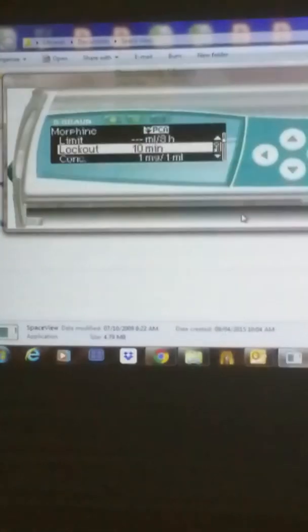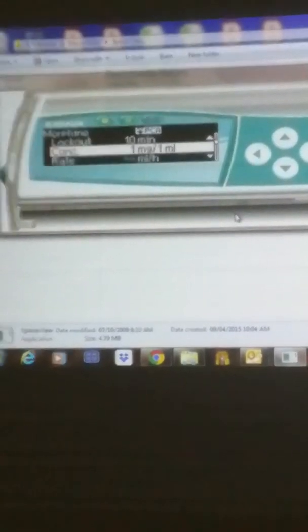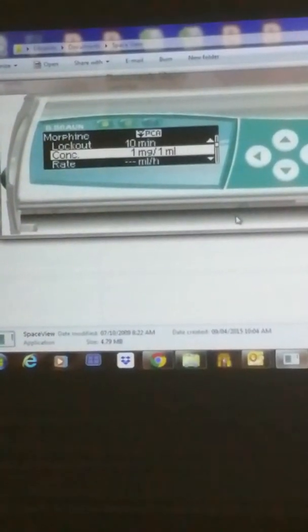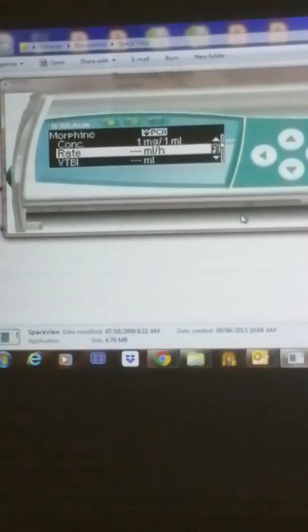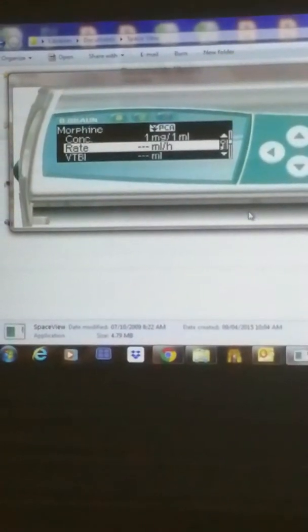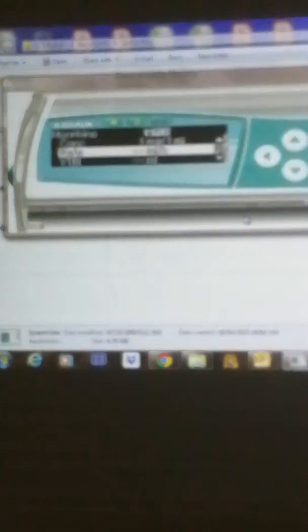The concentration is already fixed at one milligram per one milliliter. What you just have to tell the pump is your VTBI — your volume. If you tell the pump you have 40 ml, that means you have 40 milligrams, because it is one milligram per one milliliter. This rate here is the basal rate — you have the option to set a continuous rate that will keep running all the time, whether the patient presses or not.